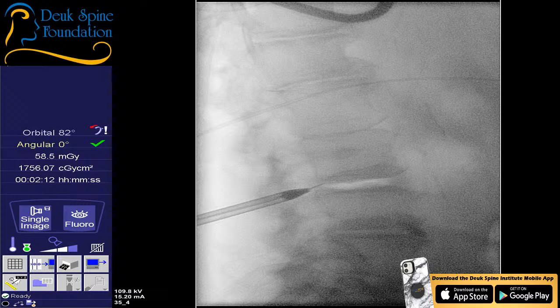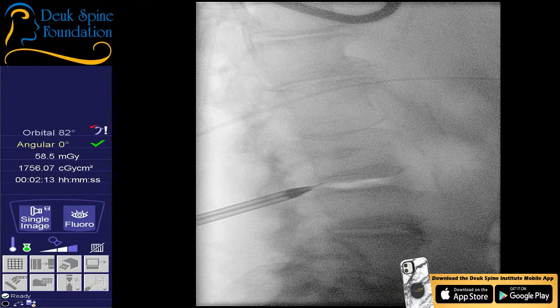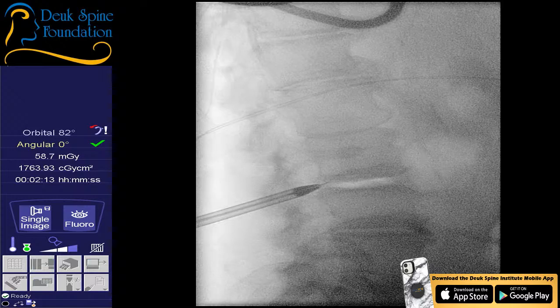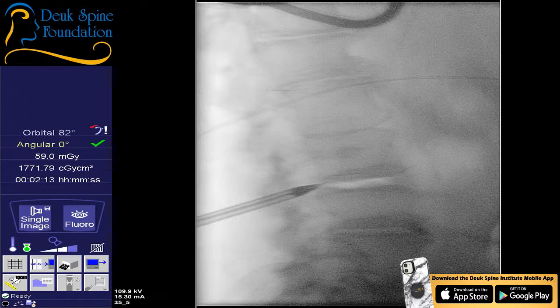Now, she never complained of any leg symptoms when I did this, but that doesn't mean 100% you're home free. That's why you have the patient awake, is to check. She's pretty good and deep, because I'm about to give her some stimulation, and I don't know that she needs anything at all. I just want to warn you. So we're right there.